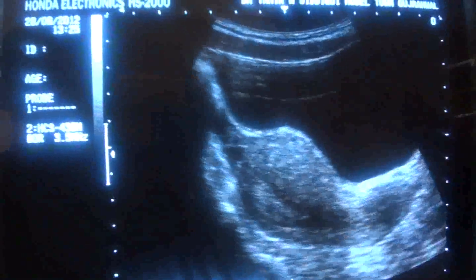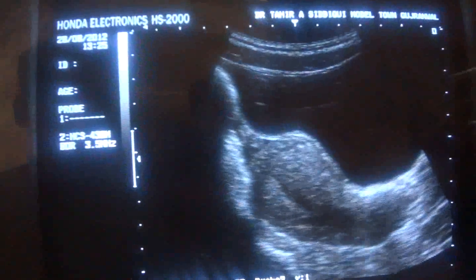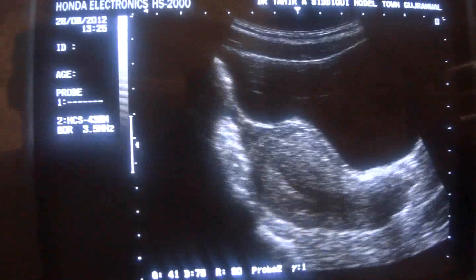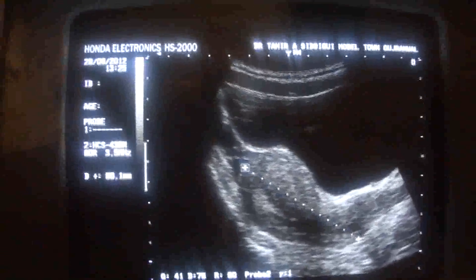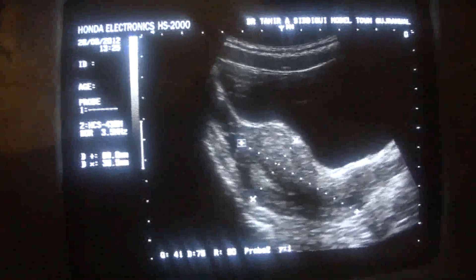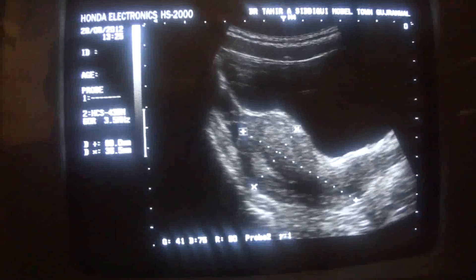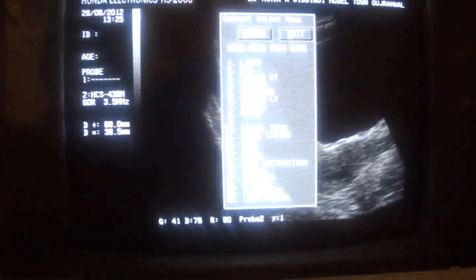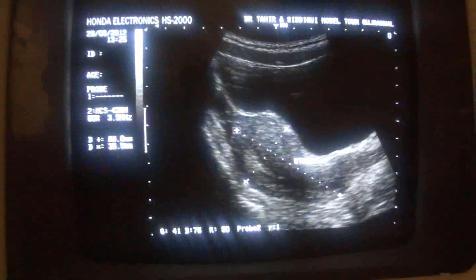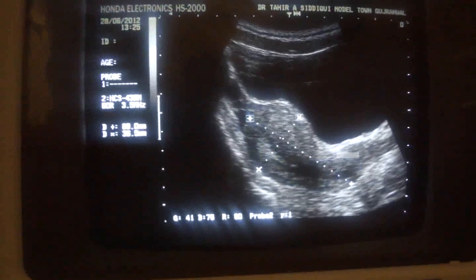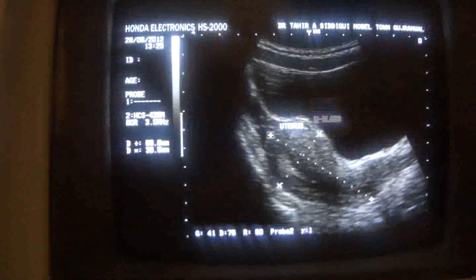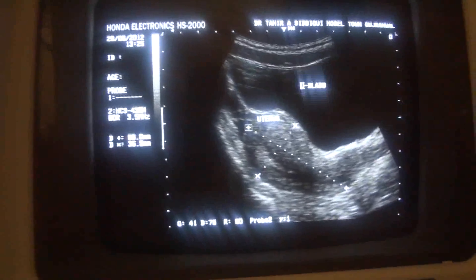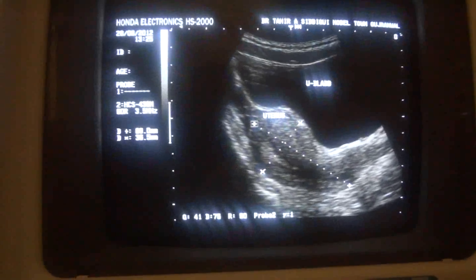This is a pelvic ultrasound of a 25-year-old young unmarried girl. This is the longitudinal section. Let's measure it first — it measures 6.9 by 3.6 cm. 6.9 is the length, 3.6 is the anterior-posterior diameter. This is the anterior surface of the uterus, this is the posterior, and this is the cervix of the uterus. Above it lies the adequately filled urinary bladder. This is nulliparous size — normal.